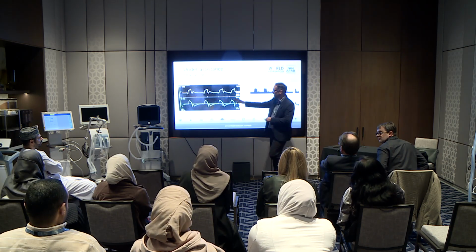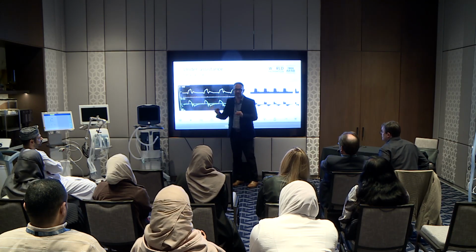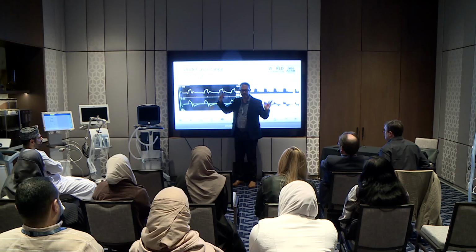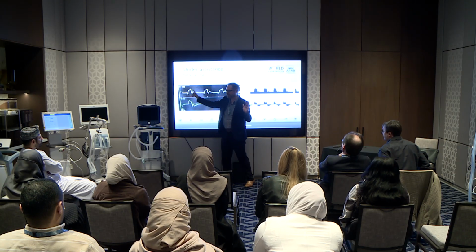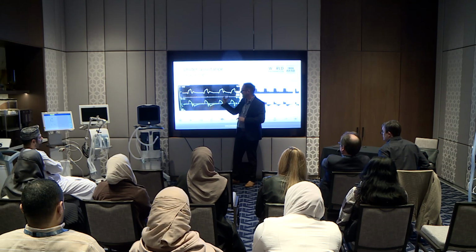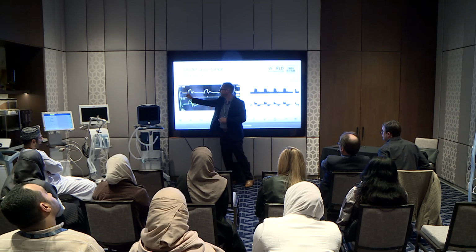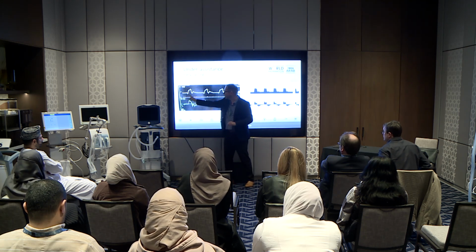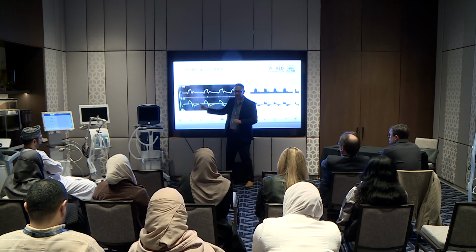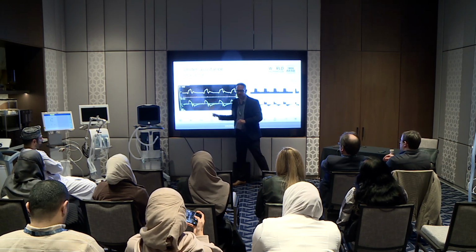Yes. So if you look here, it's very obvious the patient's triggering the ventilator. As soon as you see that, even if you just did process of elimination, this one cannot be reverse triggered because they are very clearly triggering the ventilator. What's happening here is the patient triggers. You see this increase in flow simply because the patient is still inspiring. Again, if I were to draw that red line of PMUS, it would go like this, right? So again, very close to almost breath stacking in these two breaths.